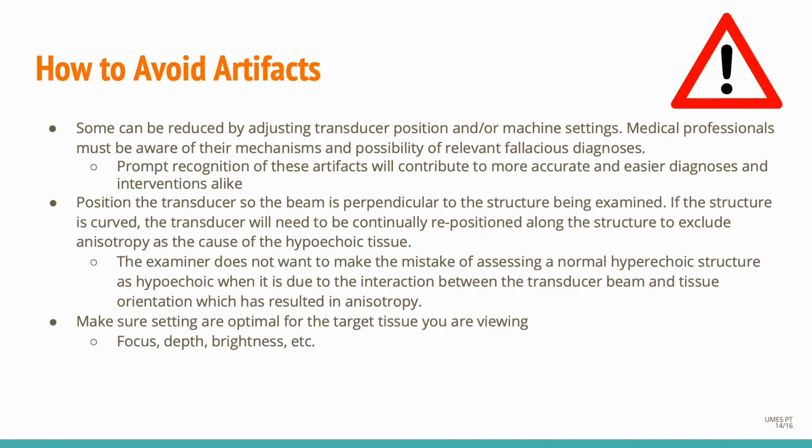So the main point is, how do I avoid these artifacts? Some of these can be reduced by adjusting the transducer position and or the machine settings, and you need to be aware of their mechanisms because they can lead to diagnoses that are not correct. Prompt recognition of these artifacts will contribute to more accurate and easier diagnoses and interventions alike.